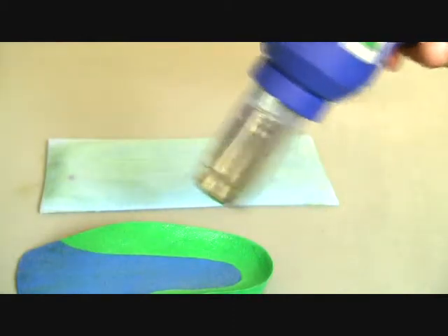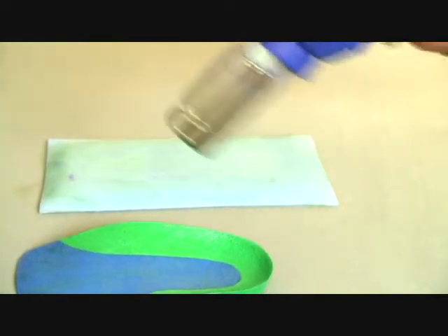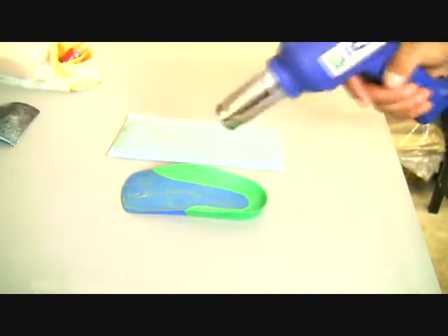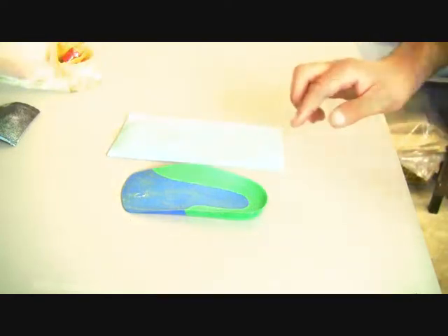Apply the glue to the PPT cover. Use a heat gun to lightly heat both surfaces so that it's tack dry. This is important to achieve the best bonding outcome.